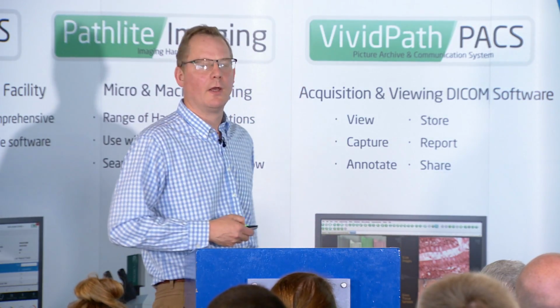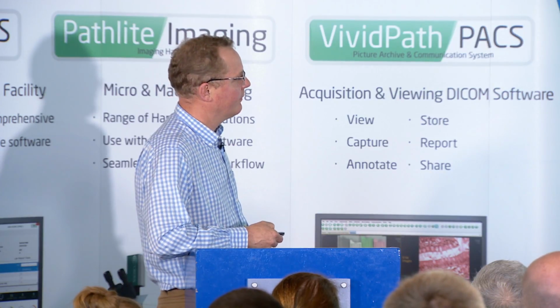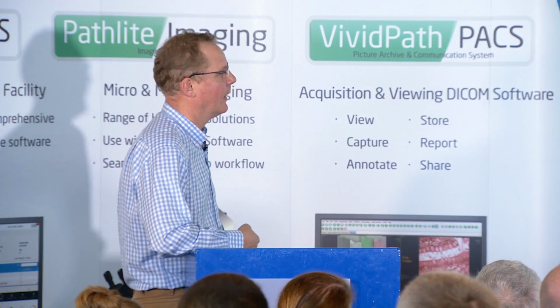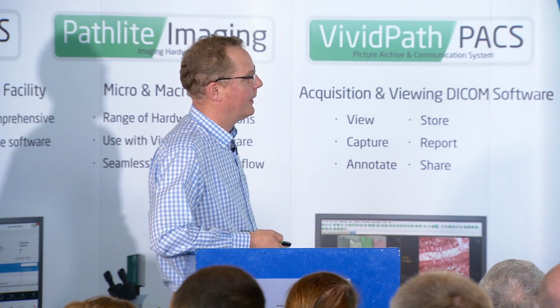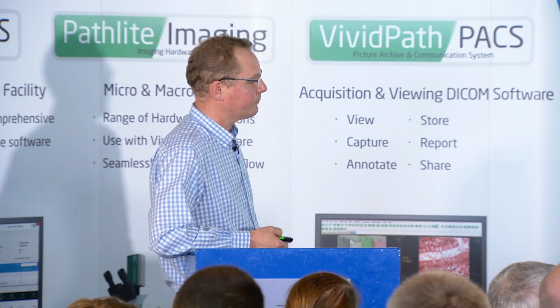The problem is, where do you draw the line between whether a tumour is infiltrating, as this one is here, or pushing, as the same tumour is doing here? And really, this is somewhere where we think the computer algorithm has a role to play in analysing the degree and the pattern of that infiltration.